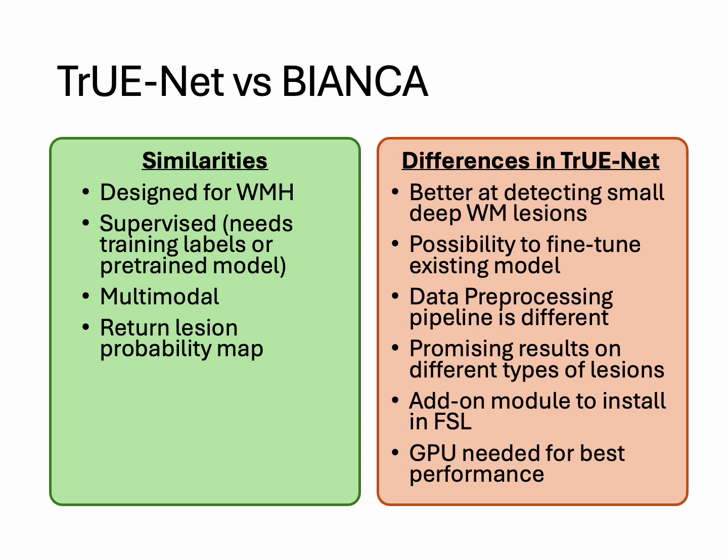It's an add-on module to install in FSL. The installation instructions are also there in the upcoming slides. We'll talk about it a while later. And the GPU is needed for best performance. It's quite a complex algorithm that's used to build TrUE-Net, as opposed to the normal CPUs that you will use for Bianca.